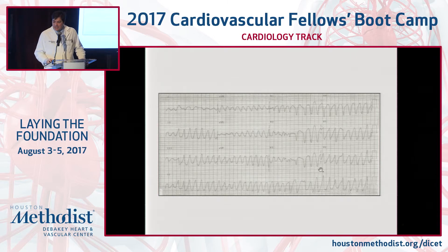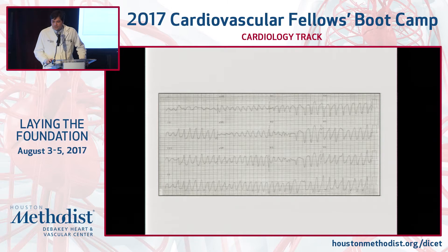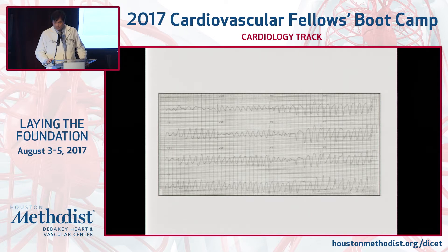Here you can see what we consider polymorphic ventricular tachycardia. You can also see this could be considered torsades de pointes because there are significant axis changes. The beauty about torsades de pointes is that the diagnosis is very narrow — usually it's prolonged QT and low magnesium; those are the usual causes.